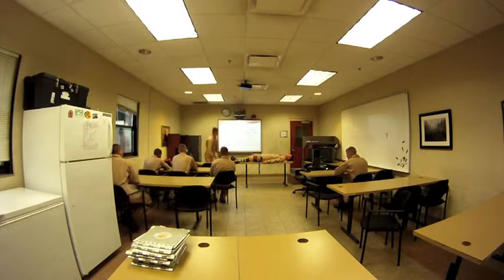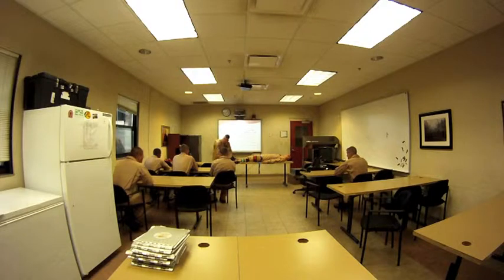All right, then from here you're going to explain what you're going to be doing to him. You're going to be telling him he's going to feel the sensation of pulling on his leg, and in order to pull, no jerky motion. Remember, there's a sharp broken bone in his leg. Any further movement can cut his artery. All right, so push and pull, push and pull. And he's going to feel that, and you basically keep going until he gets complete relief. The pain level is going to go down dramatically.